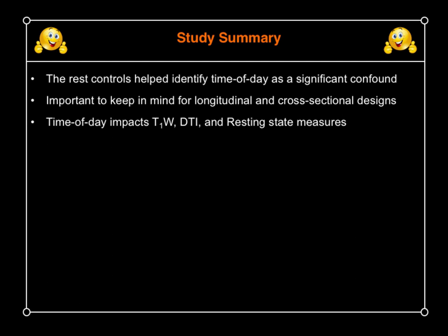Time of day impacts T1 weighted measures, DTI measures, and I haven't shown you this, but even resting state measures are affected. But by having these different measures, we get some insight into what the underlying mechanism is. For DTI, we used a slightly advanced diffusion imaging, which allowed us to look at to what extent CSF or free water is contributing to this effect.